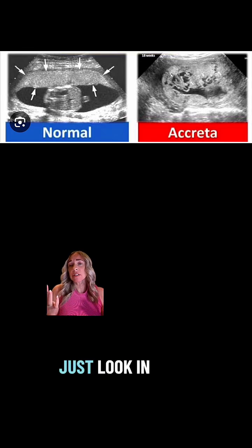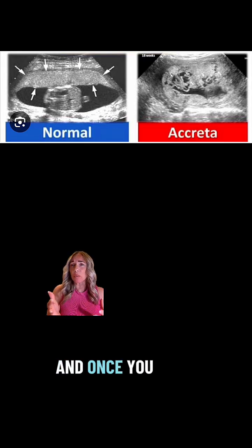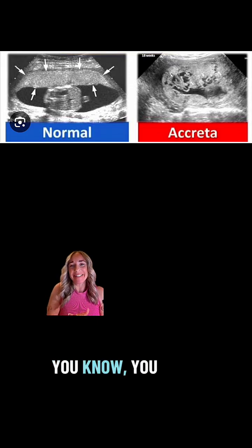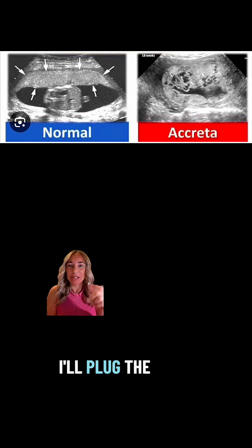So once again, just look in the patient's chart, get their history, see what's going on, and once you see these images and you train your eye and you make yourself familiar, you should be able to help your MFM diagnose an accreta.